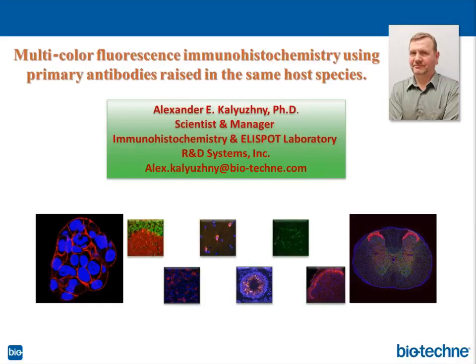you need to make sure that your secondary antibody is not binding to your first primary antibody. In other words, your secondary antibody is not binding to an irrelevant target. The way to do it would be, for example, let's say we're talking about DIG-labeled primary antibodies.